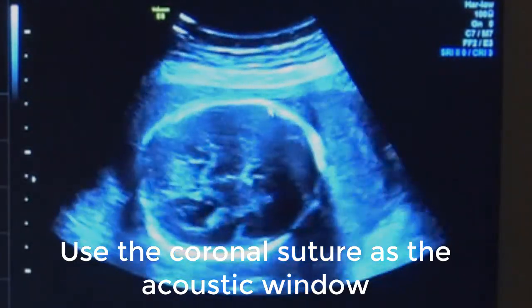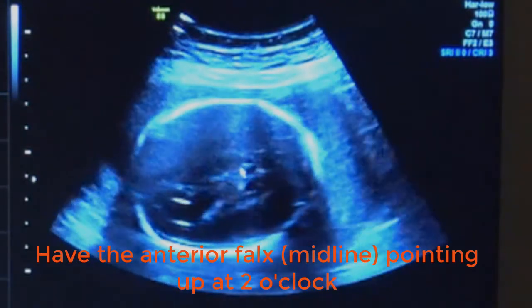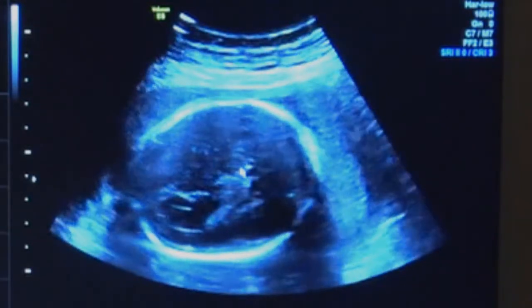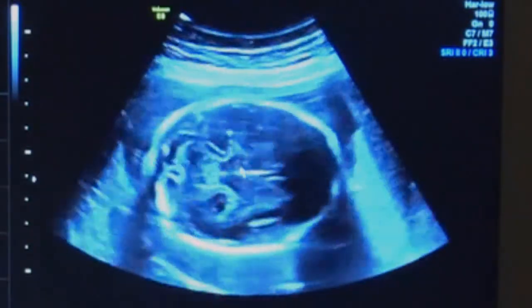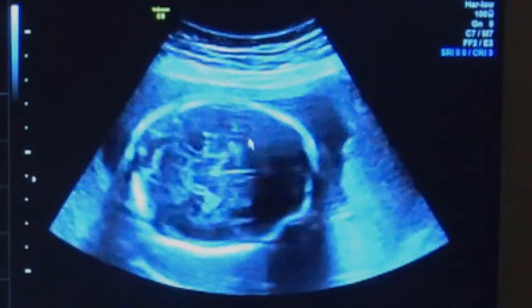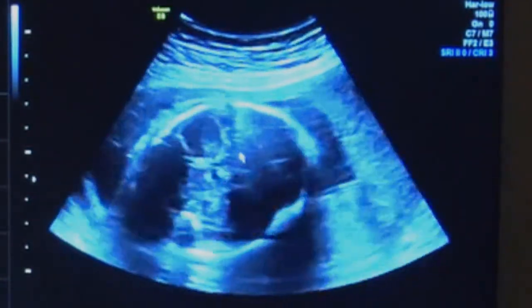So if you just tilt up, you should be able to pick up the MCA running. It'll pretty much run parallel with the ultrasound beam, straight up towards the camera, and then normally it runs a little bit more anteriorly. When you're angling through that suture, you won't have to angle correct.